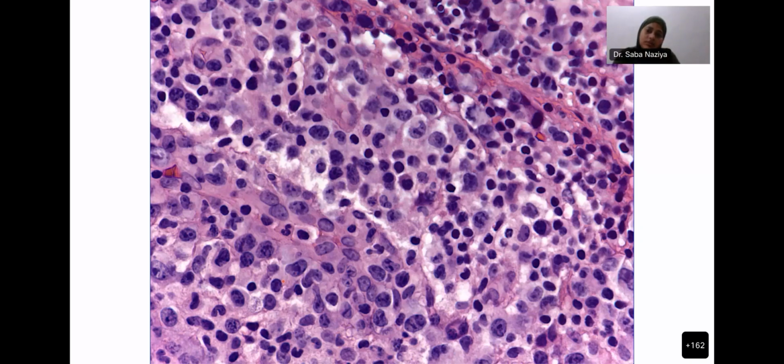This is a tough case. And outside I already told you it had been diagnosed as a reactive hyperplasia with an immunoblastic proliferation. So it's an excellent idea. But there's also, Mike, can you see some horseshoe shaped cells there? Yes, in the very center. Good idea. Very good idea.